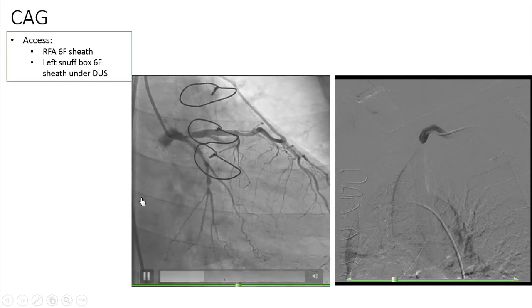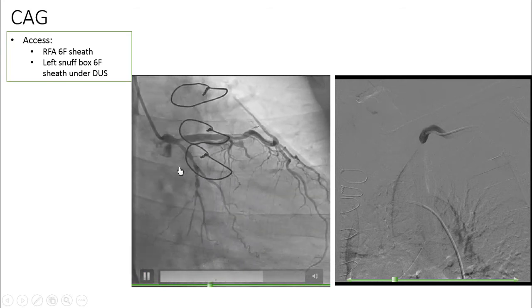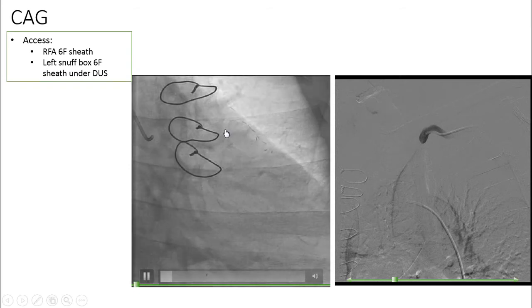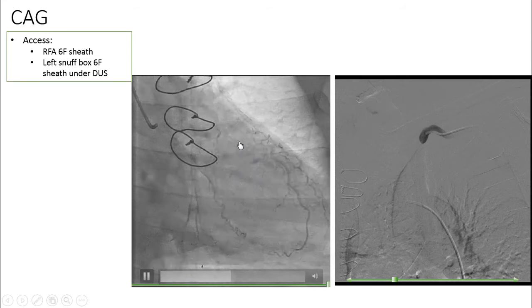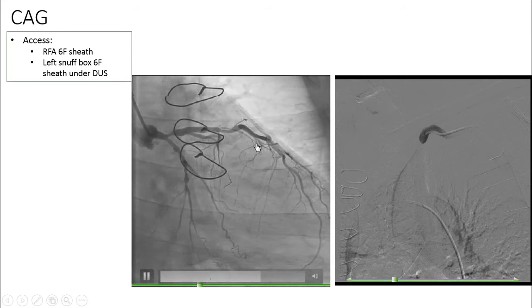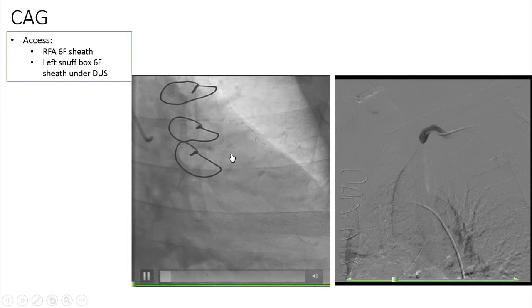Coronary angiography showed patent left main, significant stenosis of LAD and LCX. And as you can see, the left internal mammary artery is filled retrogradely from the LAD — it is not filling the LAD, but rather is being filled by the LAD.